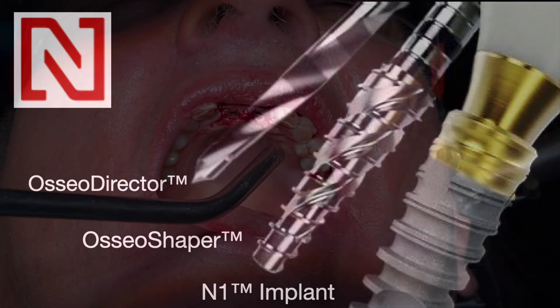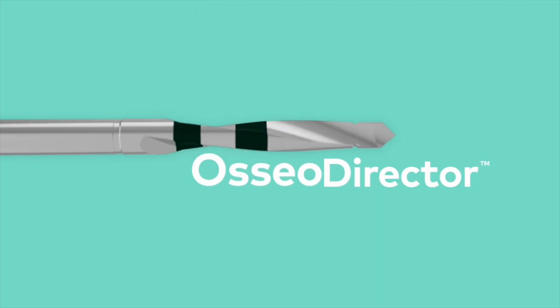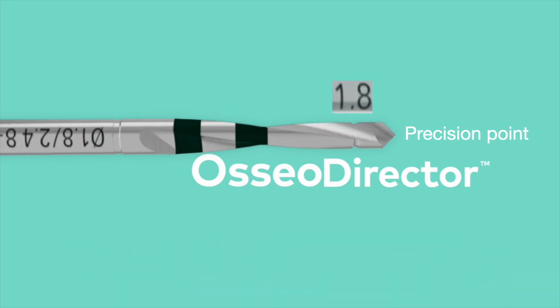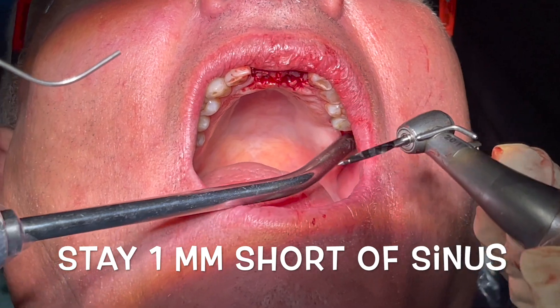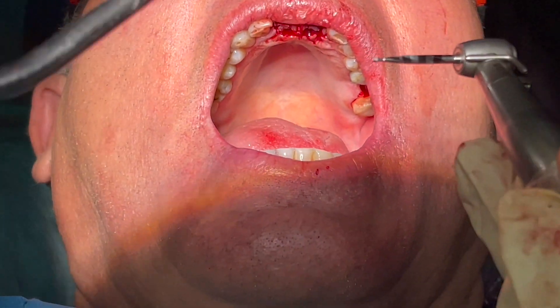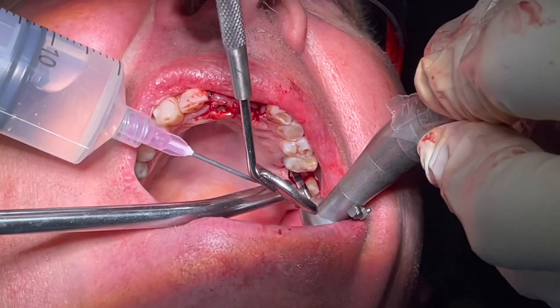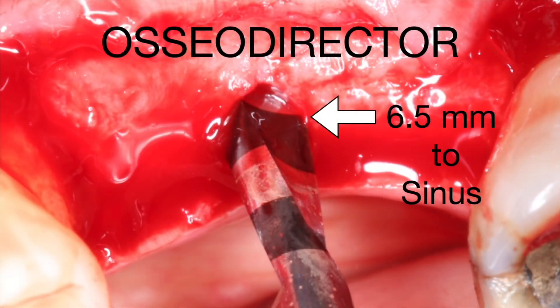We're going to use the Osseo Director drill first. This is a tapered drill with a pointy tip, operated at 800 RPM using water, going from 1.8 to 2.4mm. This is going to slide into the 2 millimeter osteotomy really easily. As we go in, remembering it's plus one, we'll measure where we are, and it's going to follow that 2 millimeter guided hole perfectly, cutting to 2.4mm while staying 1 millimeter short of the Schneiderian membrane and the floor of the sinus.